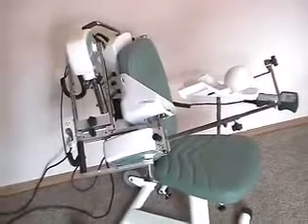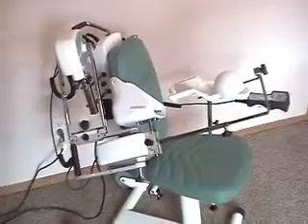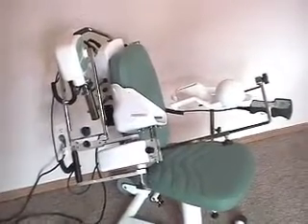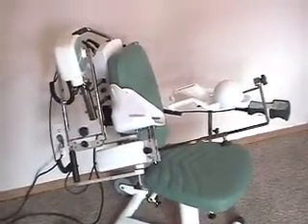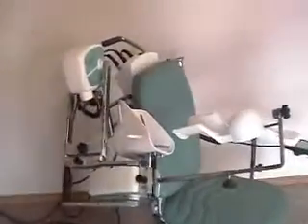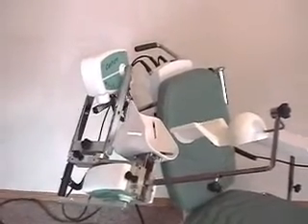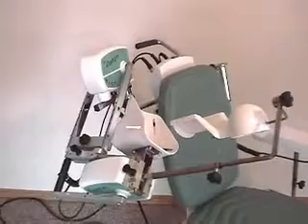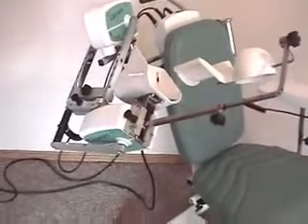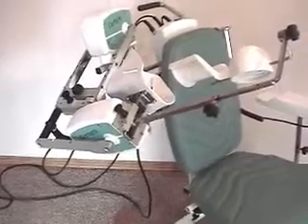Here we have the ab and adduction with associated rotation splint setup. In this case we are only doing ab and adduction at the moment. Only the first motor, M1, has any motion going on. M2 is simply along for the ride — there is no rotation occurring.